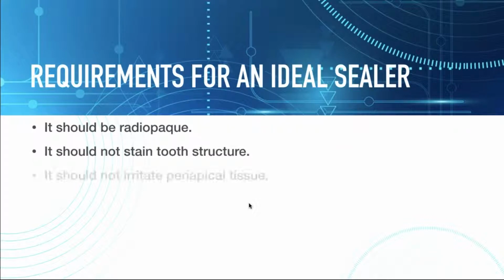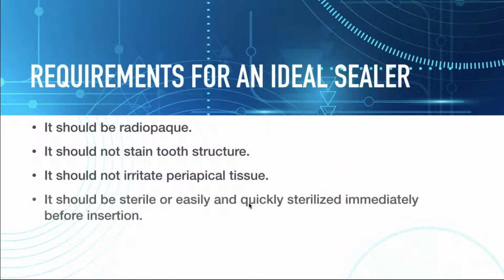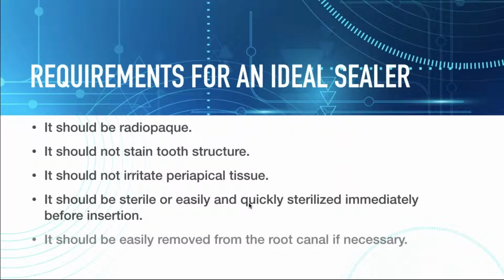And of course, we don't want it to stain tooth structure. We don't want that proverbial dark tooth after we've done root canal treatment. So these are the requirements for the ideal sealer. What kind of sealers are available?